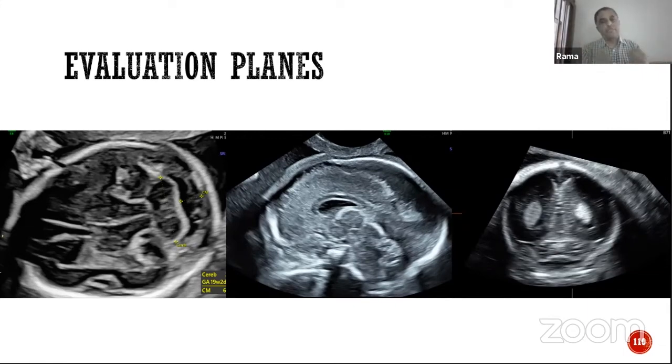So the presence of the kidney bean shape, the presence of the fastigium, the presence of the primary fissure, and this 1/3, 2/3 arrangement all tells me that the vermis is normal in size and shape. You can objectify the size by doing a cephalocaudal diameter as well as an anteroposterior diameter.